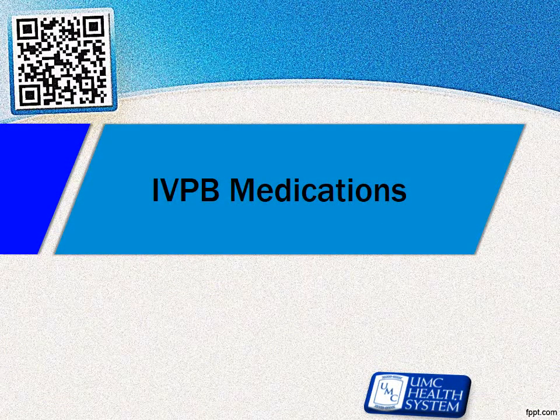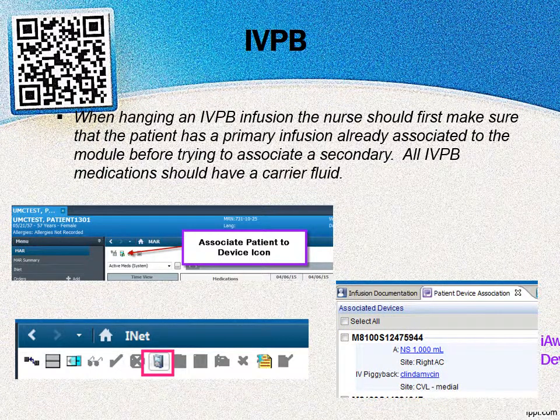IV piggyback medications. When hanging IV piggyback infusions, the nurse should first make sure that the patient has a primary infusion already associated to the module before trying to associate a secondary. All IV piggyback medications should have a carrier fluid.